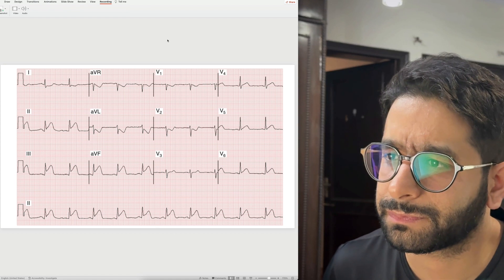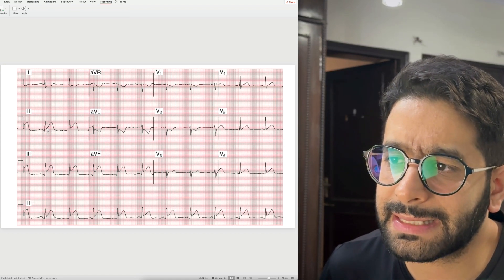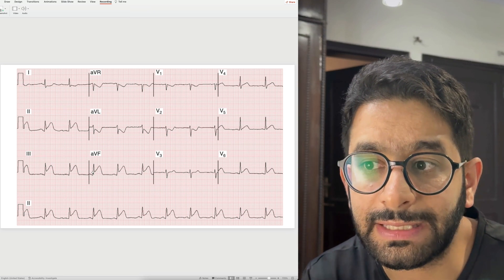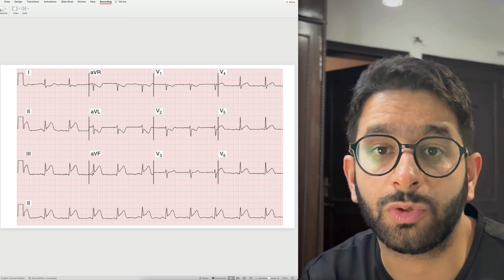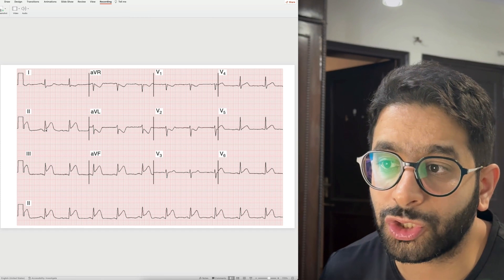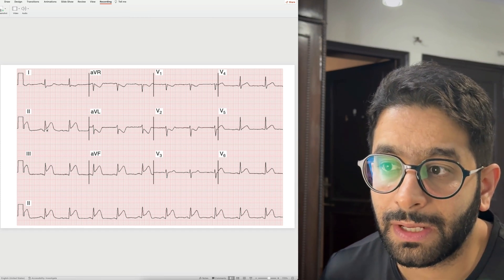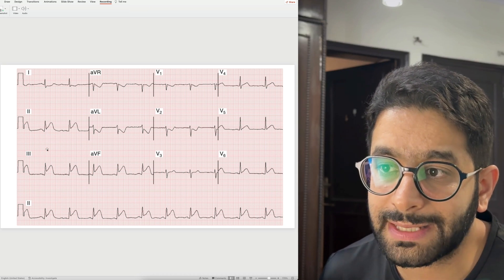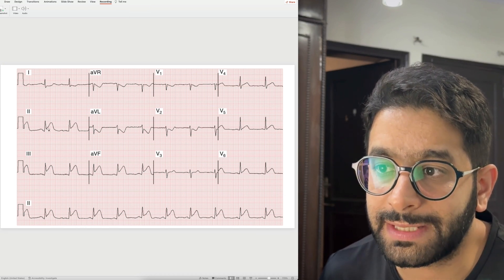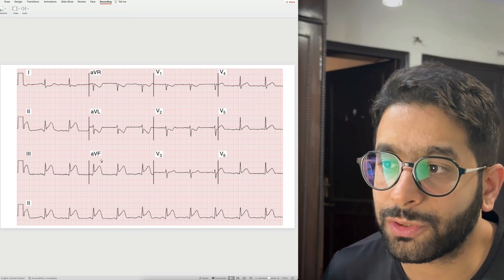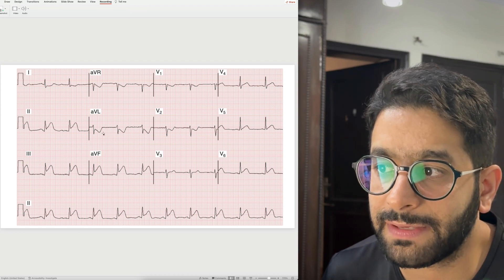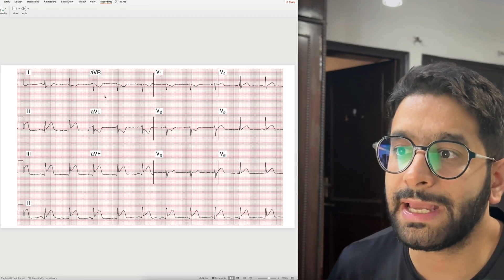Let's start with this ECG. What you need to recognize is ST segment elevation, because this is something you cannot afford to miss. Somebody presenting with chest pain with this ECG — whether you're an MBBS doctor, a physician, or a surgeon — you should be able to recognize this. Look at the point where the QRS meets the ST segment — see how elevated it is from the baseline. ST elevation is present in leads II, III, and aVF, so this is an inferior wall ST elevation MI.